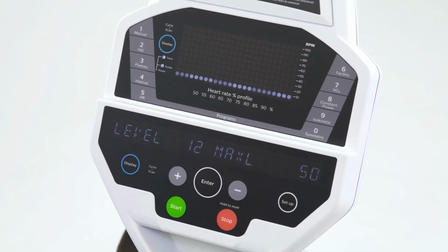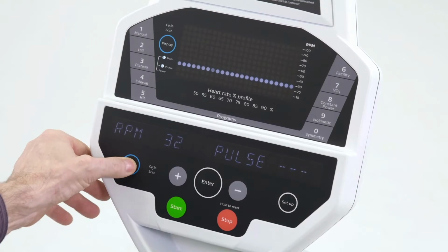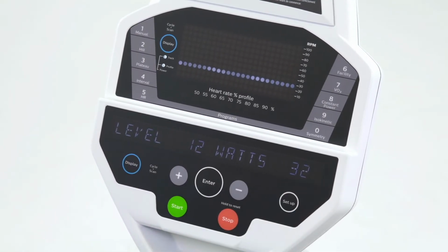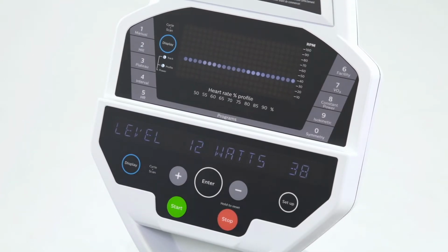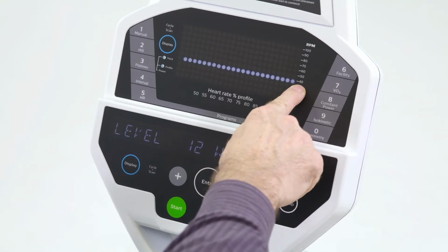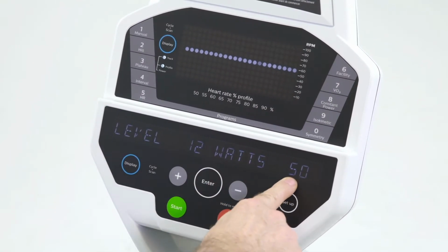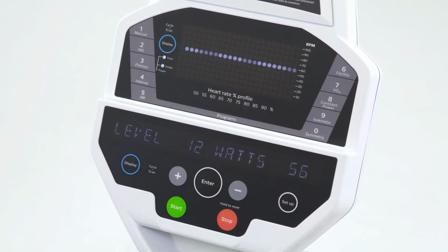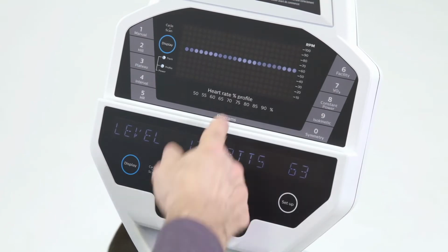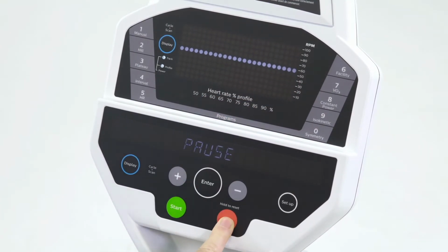So now when I increase my resistance, the higher the watts goes. Right now I'm at 30, so I have 3. Now I'm higher, so it's 4 rows of lights. That's 40 watts. And you can sort of see on the scale there, it's showing 40. I'm at 60, which actually, it takes a little while to catch up to the power that I am putting out. So you have a visual feedback of the amount of power that you're pedaling at.